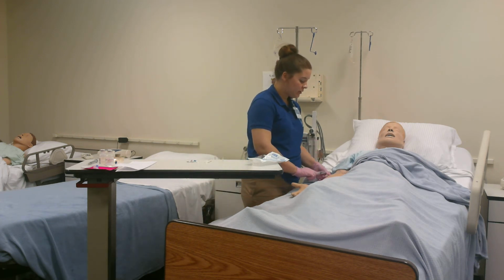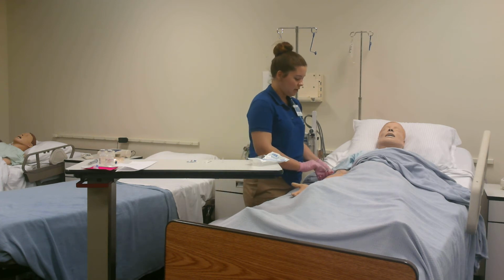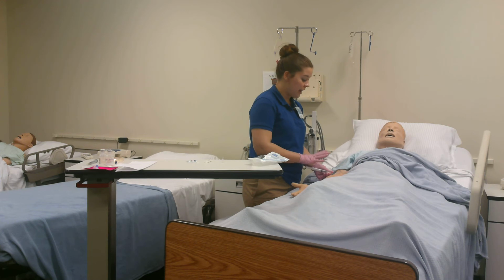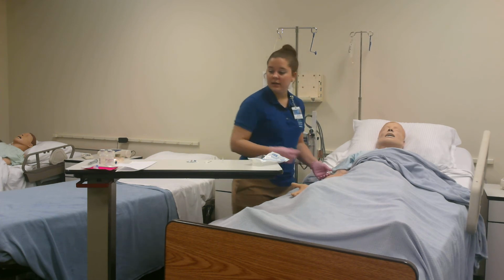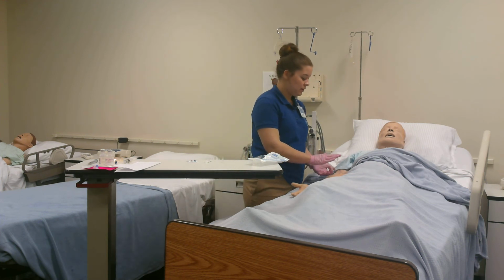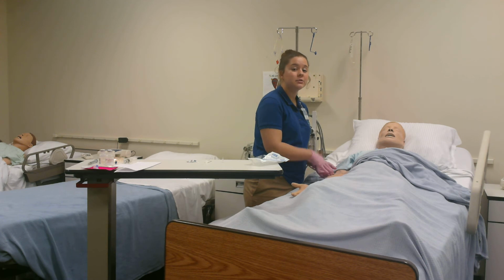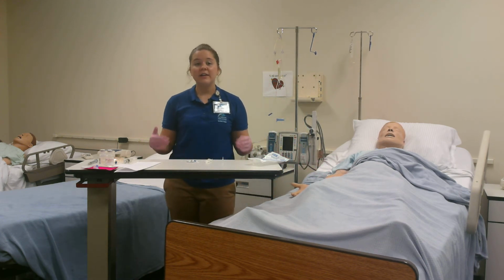I'm going to do 3, clean it, and then I'm going to do 3 milliliters, half a milliliter push, half a milliliter stop, half a milliliter stop, until we get to 3 milliliters. And I would then dispose of this properly and push heparin if it was ordered, but it was not ordered in this case. So I'm going to dispose of everything in the sharps container.